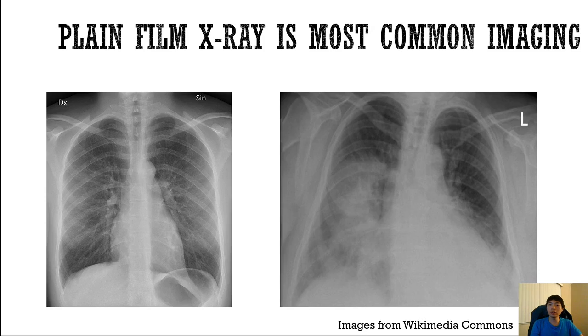Again, because these are projectional X-rays, we don't really know exactly where the fluid is along the depth dimension. We just know where it is on the left, right, and the top and bottom, but we don't really know exactly where the fluid is in 3 dimensions.